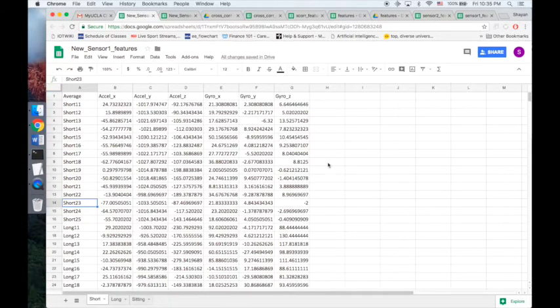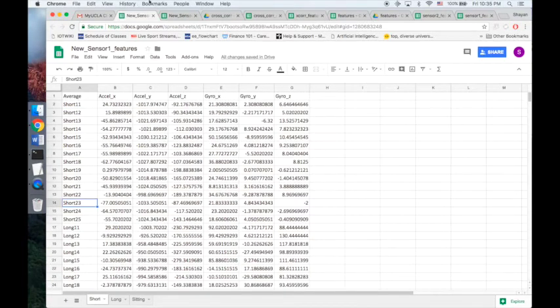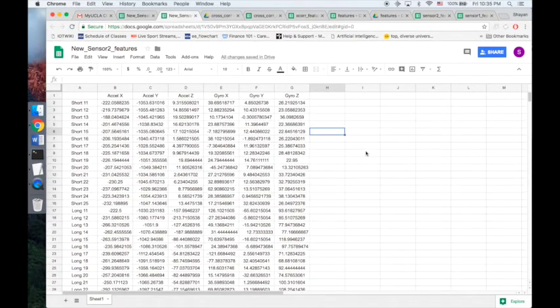We do not include magnetometer data, and the reason is because the magnetic field of the Earth does influence the magnetometer sensor when you walk in different directions. Now this is the collected averages for the Sensor 2 set of trials.